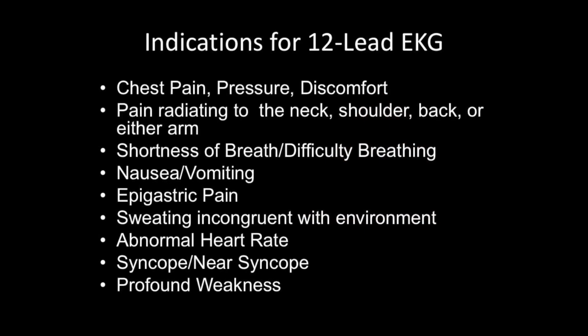And then there's always this question, so when are we going to do a 12 lead? Obviously the question is, when do we do these, right? So when are we going to do a 12 lead EKG? And it is not that we're only going to do them on chest pain or chest pressure patients, but rather on a larger population. And one of the reasons is that not all patients that have an MI present with chest pain. There's actually quite a percentage of people that present very differently. So for example, they could present with just epigastric pain, right?